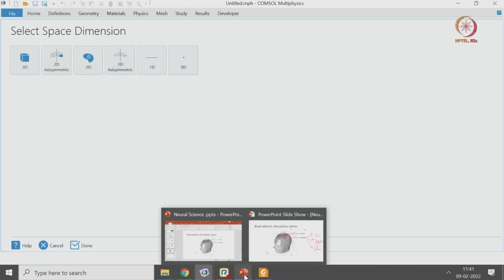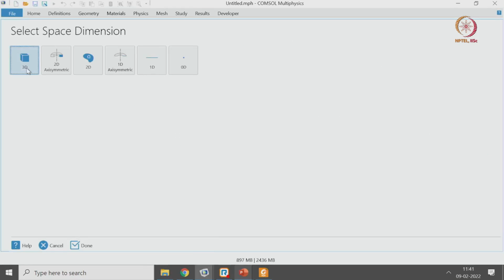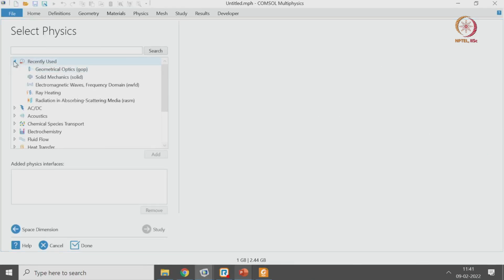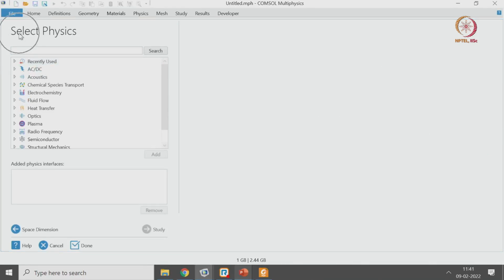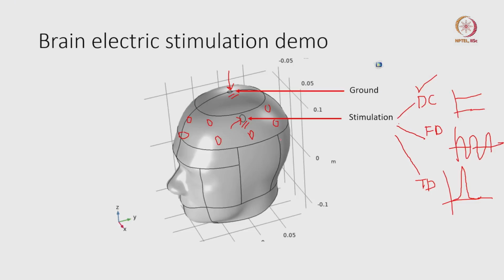Our simulation that you can see over here is a 3D simulation, so we are going to choose the 3D dimension. Once you select the dimension, it asks you to select the physics. Coming back to this figure, we are going to give voltage as an excitation, or current per se. So the physics that we are going to solve is the flow of current within the tissue.